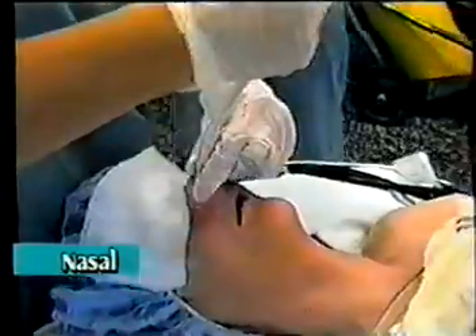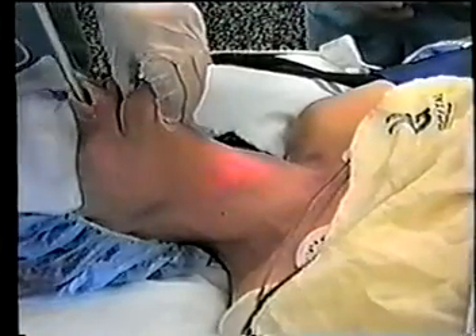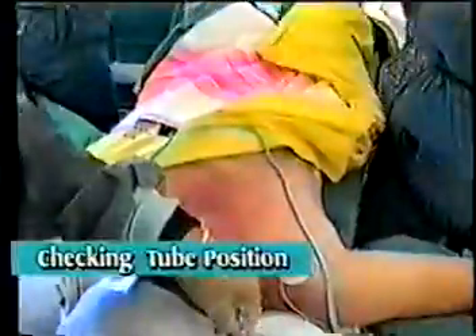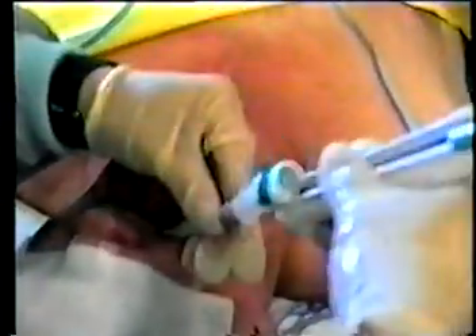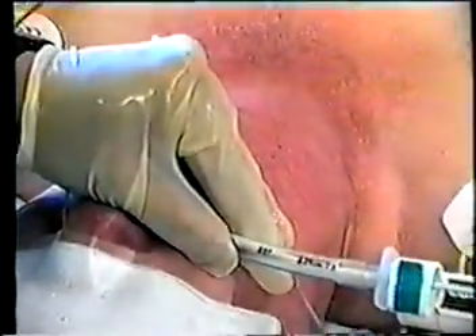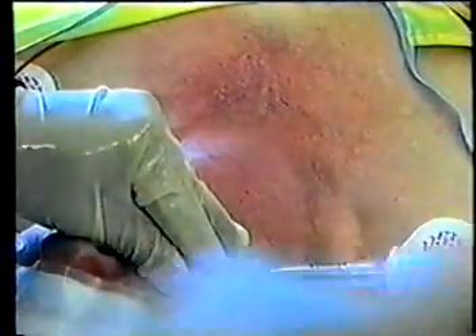Recent research has shown light-guided intubation to be equally useful when a tube is to be placed nasally. In experienced hands, this technique is also rapid and relatively easy. For patients who have been previously intubated, the glow from the TrachLite can quickly provide confirmatory evidence that the tube is in the trachea and allow the tube tip to be accurately positioned. When the numbers on the wand align with those on the tube and the glow is seen at the sternal notch, research has shown that the tip of the tube is almost exactly midway between the cords and the carina.